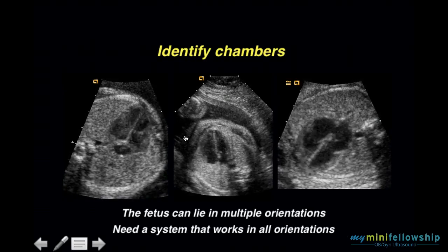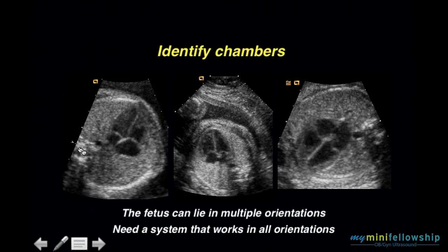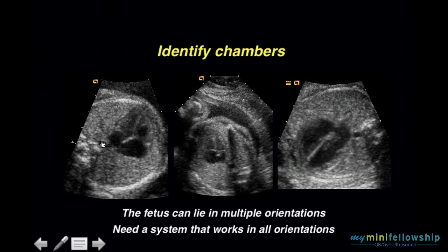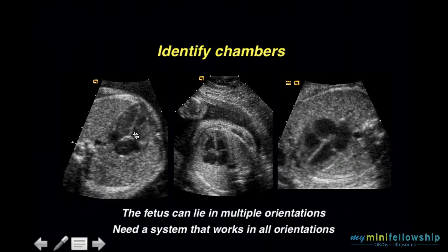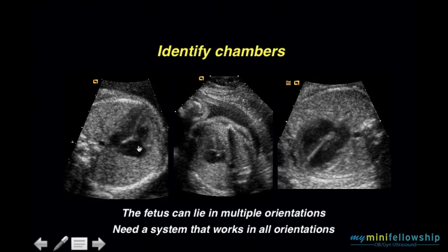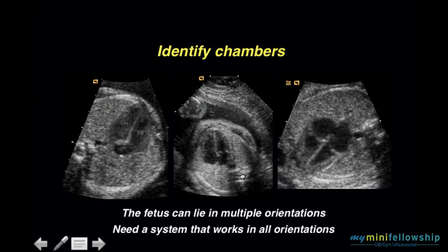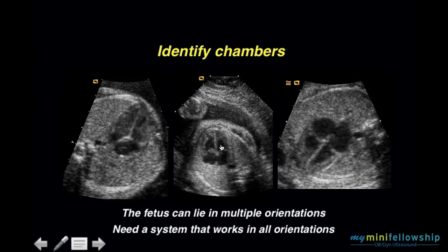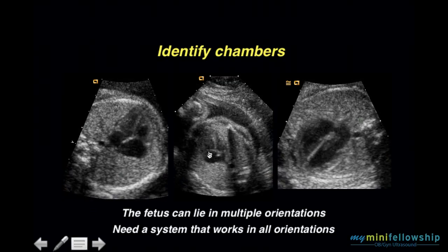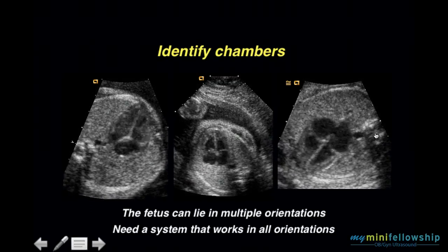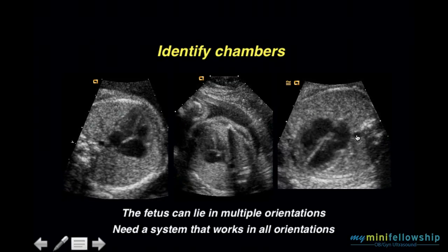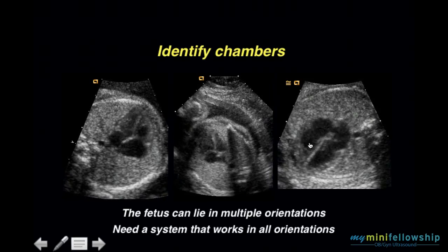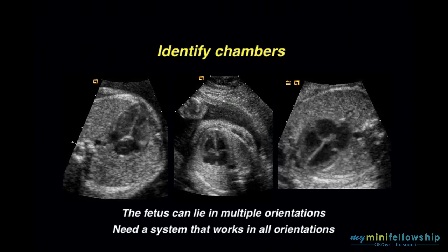Three fetuses, all in different orientations. For each one: spine, descending aorta, left atrium, left ventricle, right ventricle, right atrium. The system works consistently regardless of how the fetus is positioned.